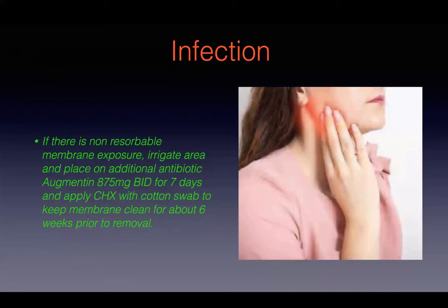Here's a panel that I took of it. Right before the surgery, he wanted to have implant 12 placed. So I said, okay. So we placed number 12 along with 7 and 10.